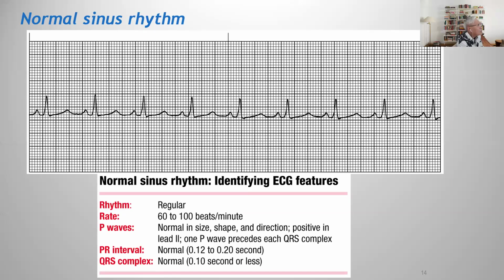And so when you're looking at an electrocardiogram, you're going to notice that on top or at the bottom of the paper is going to be a straight vertical line right over here. Each vertical line is actually going to represent 3 seconds. So this is also 3 seconds and so on.